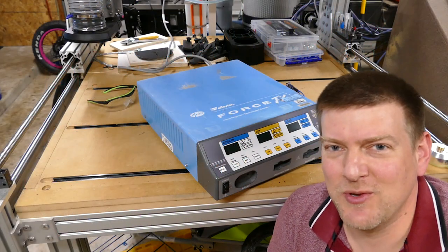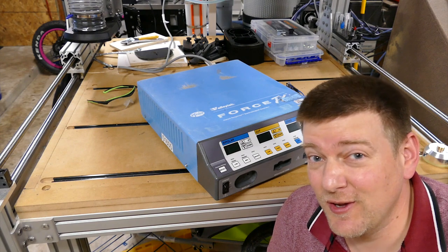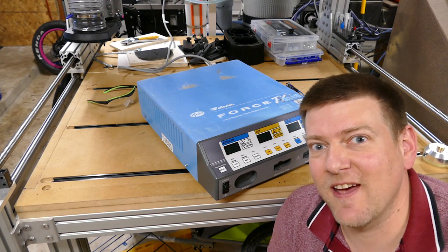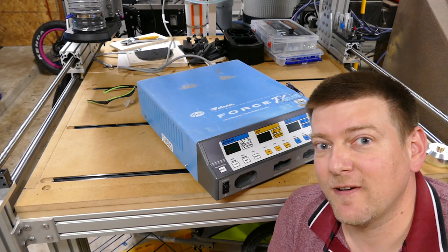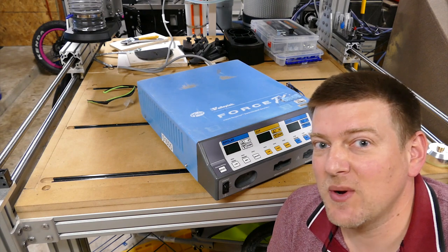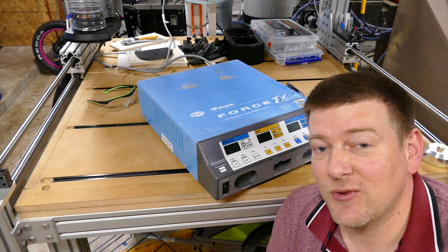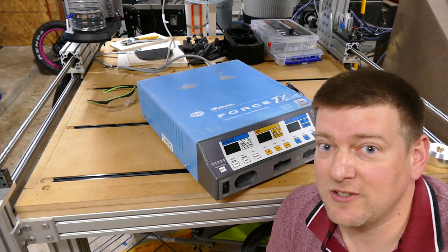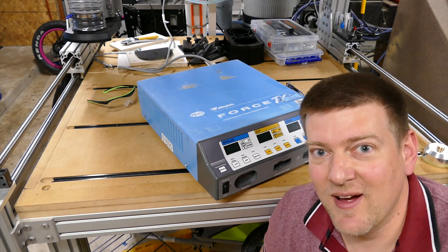Are we now going over museum pieces on this channel? No. This is still the workhorse after 20 years, the Valleylab Force FX. So what's going on with this guy? Well, we're gonna find out. It's starting to show its age. This beaut right here, she was made back in the 90s. 20-some years old, still ticking, still a workhorse, but she needs a little bit of love. Stay tuned, right here on Better Biomed.